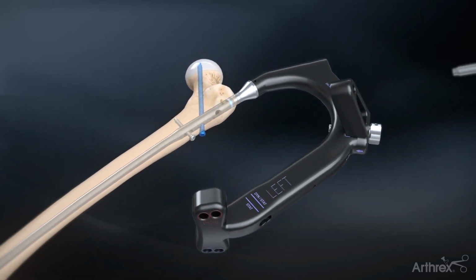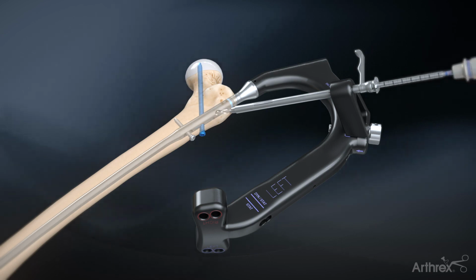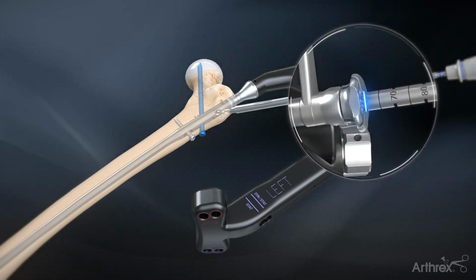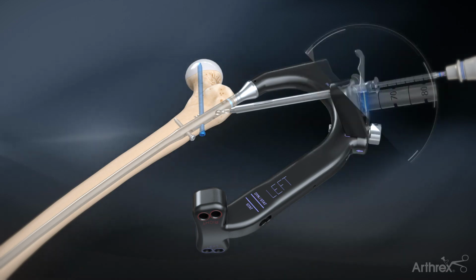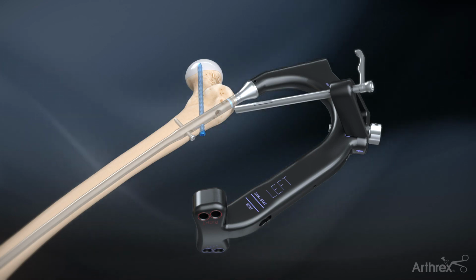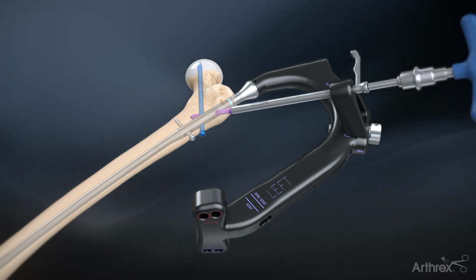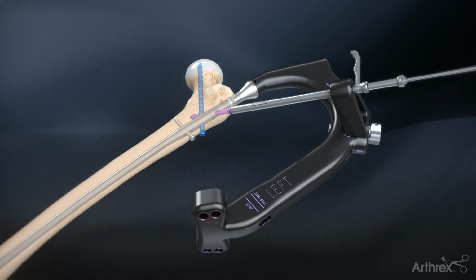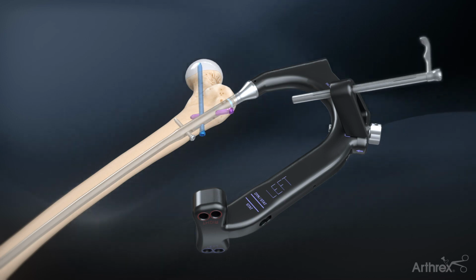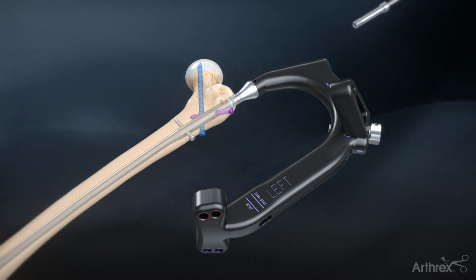Slide the screw sheath, purple, yellow, blue 5.5 mm drill, and obturator assembly through the proximal hole in the targeting guide. Drill to the appropriate depth using the calibration marks on the drill. Insert the 6.5 mm fully threaded cortical locking screw assembled with the captured hex driver through the screw sleeve until the laser mark is flush with the end of the sleeve. Remove the screw sleeve. Finally, use the ball hex driver to uncouple and remove the targeting arm from the nail.